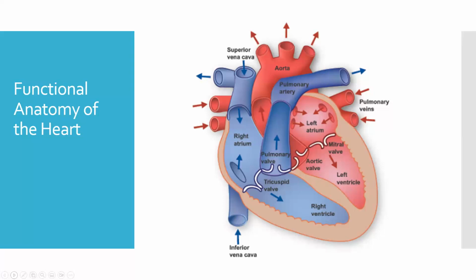As you go further back, pulmonary artery pressures will also be elevated. Go further back, and even central venous pressure, which is way upstream, may well be elevated, though not to the extent of the pulmonary artery and pulmonary capillary wedge pressures.